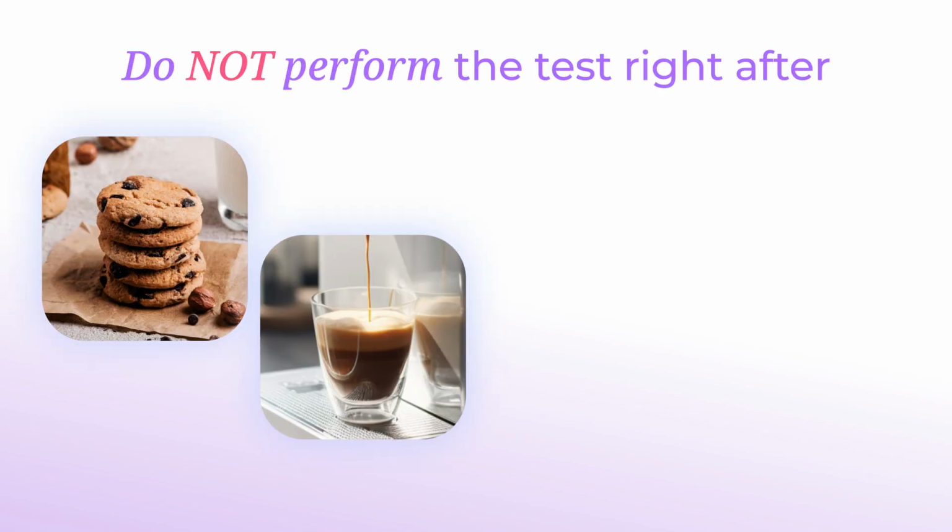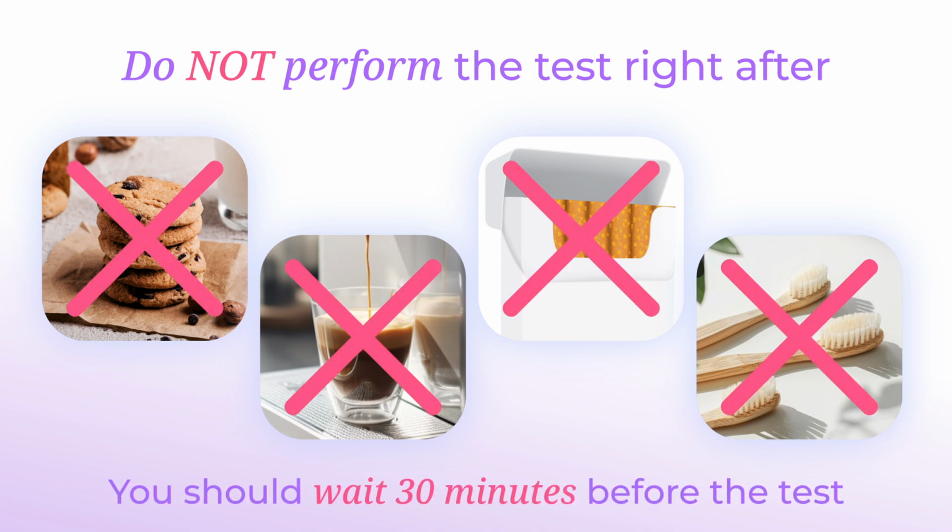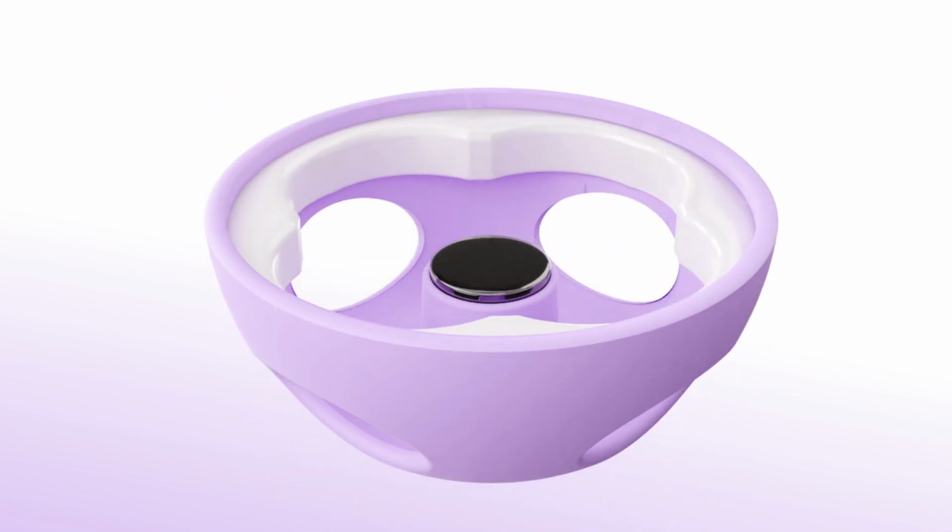Do not perform the test right after eating, drinking, smoking, or brushing your teeth. You should wait 30 minutes before doing the test to ensure accuracy. Now you are ready to start the test.